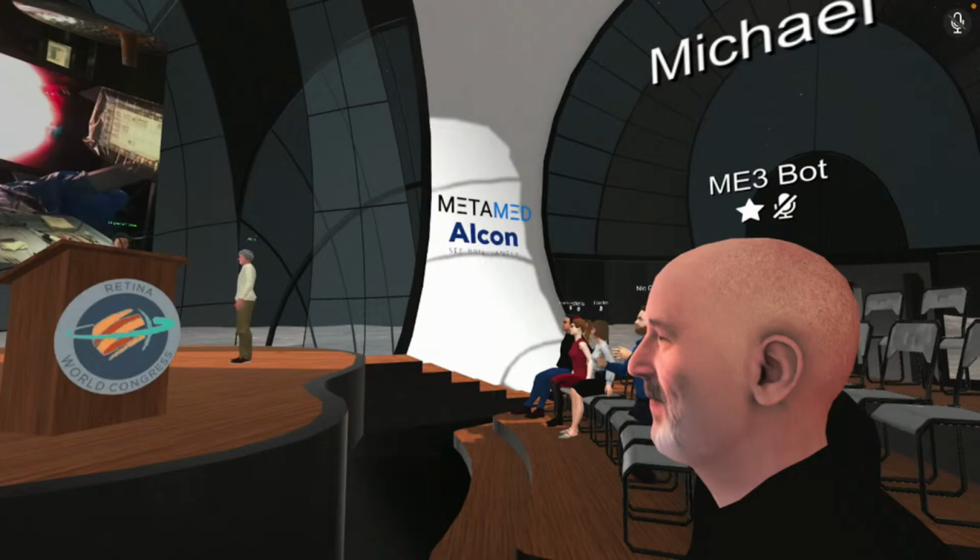Okay. So I usually use just a straight light. The reason why is by using the straight light, we can focus on the tissue where we want to observe. However, we can also use a chandelier light, and we can observe the wide field surgical view and perform panretinal photocoagulation like that.